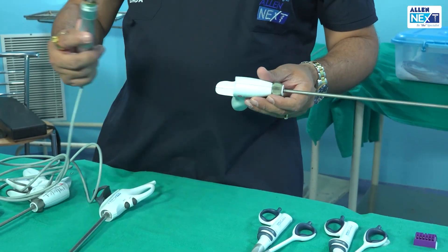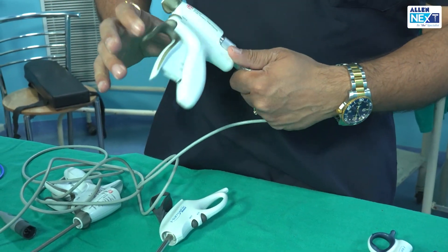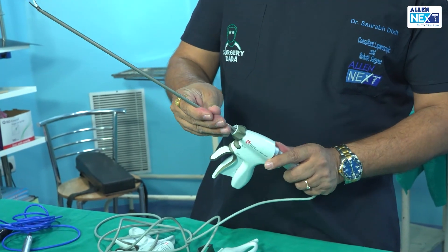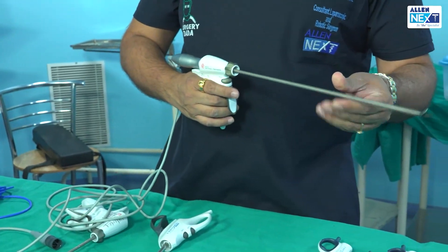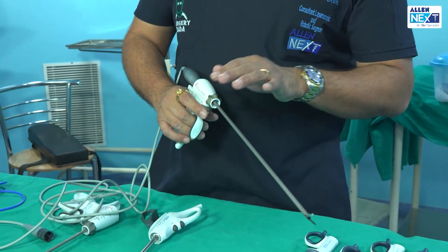Whenever this gold-plated ring gets blackened, the harmonic instrument handpiece has to be changed. The ultrasonic transducer is attached behind and then tightened. Once tightened, it is connected to the classical machine and will start to function. We have hand switches and can also use the foot pedal.